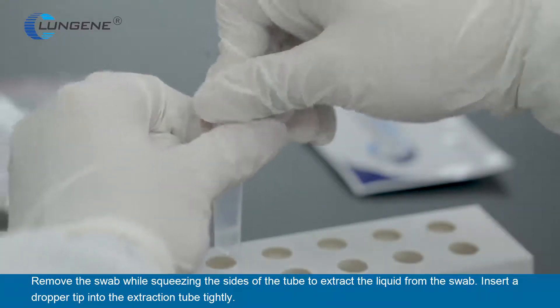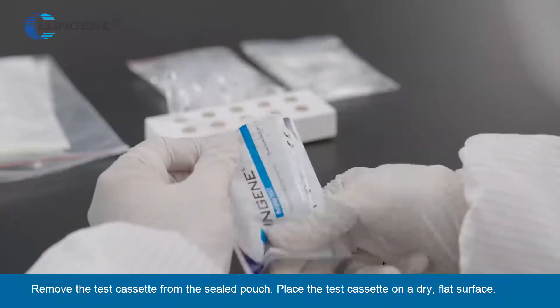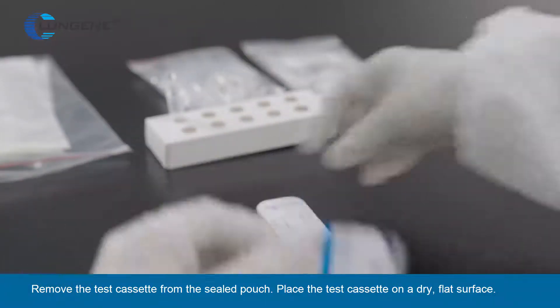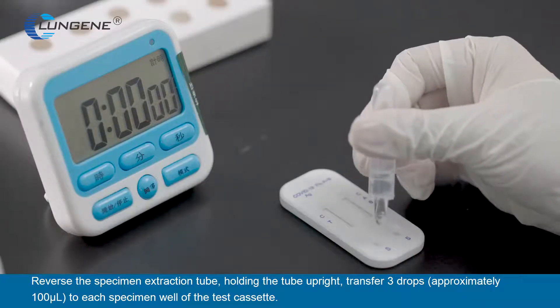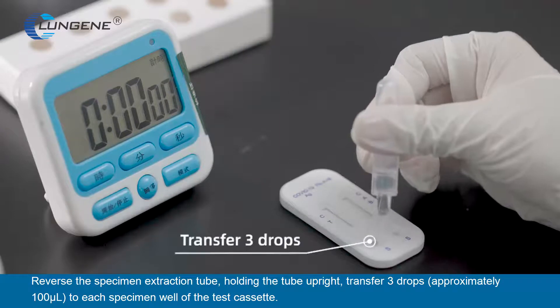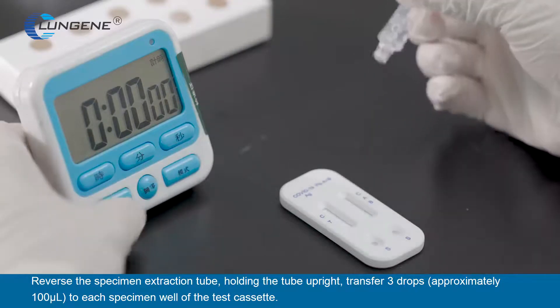Insert a dropper tip to the extraction tube tightly. Remove the test cassette from the sealed pouch and place it on a dry, flat surface. Reverse the specimen extraction tube, holding the tube upright, and transfer three drops (approximately 100 microliters) to each specimen well of the test cassette.